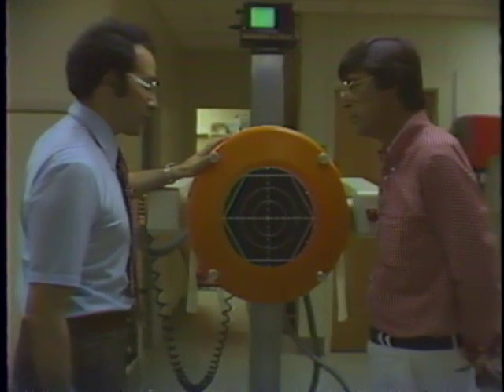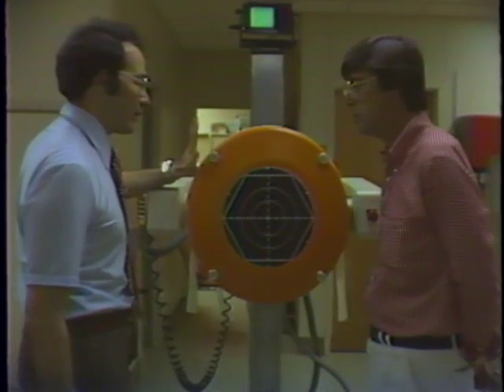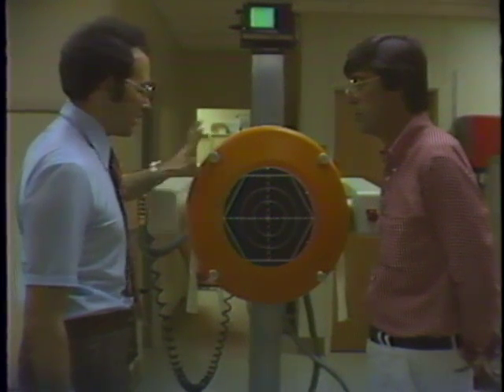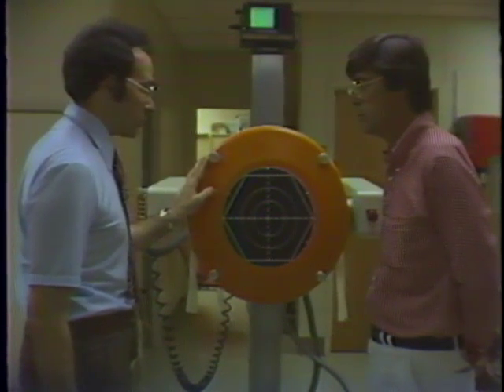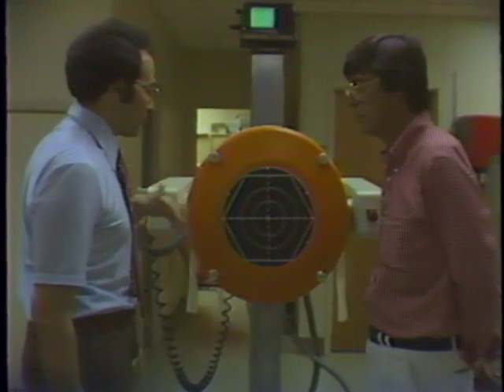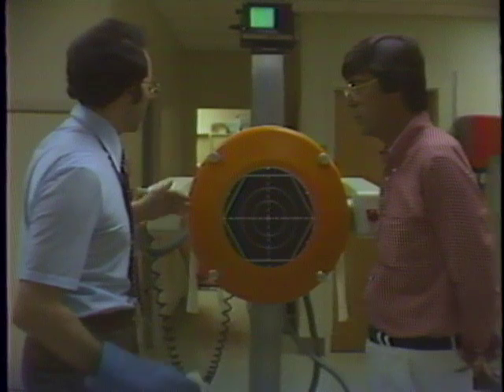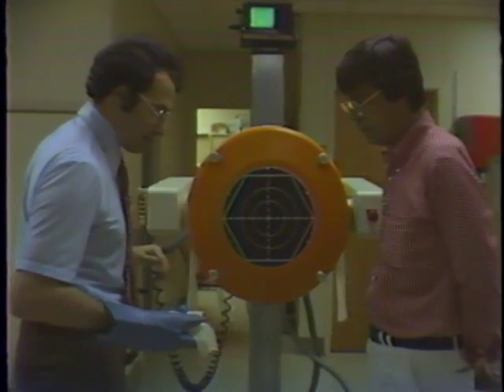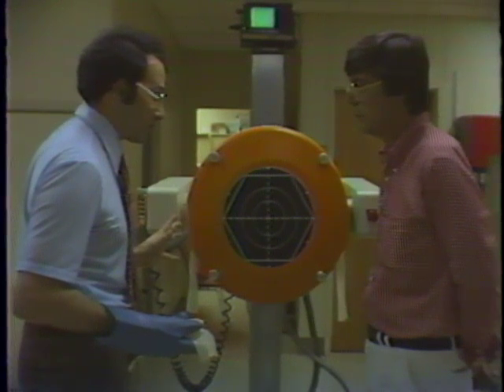Well, this is the detector head of the gamma camera, and once we have the radioactivity in the place that it should go inside the patient, this detects the radiation and it remembers where it sees the radiation, so that it can really draw us a picture of where the radiation is. And I'll show you, like this is just a point source of radioactivity. It's a little bottle and it's got some radioactive material in it.